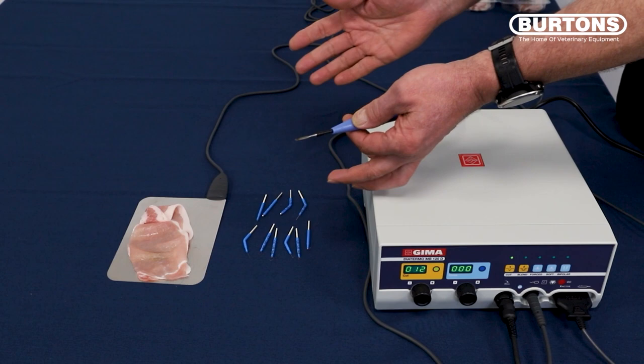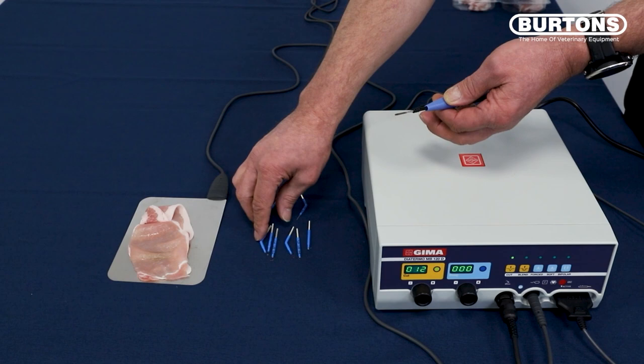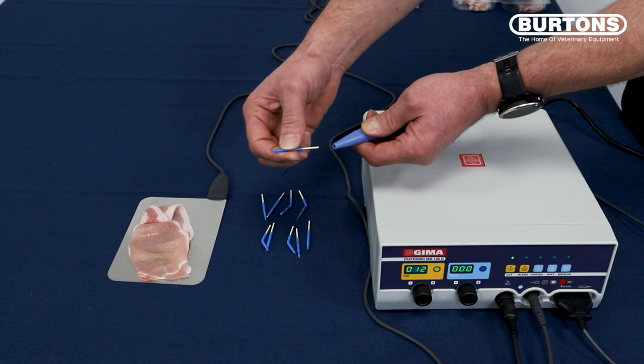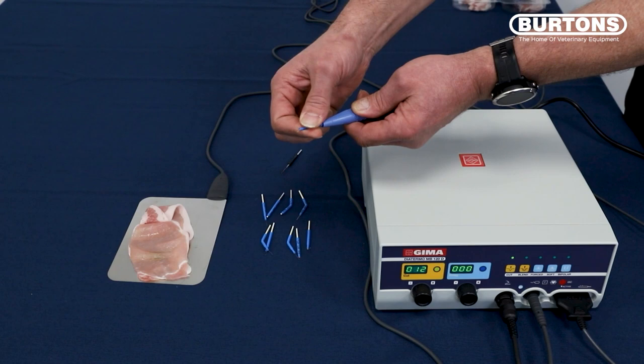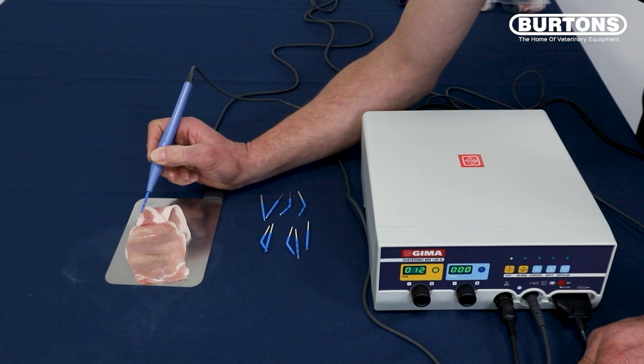I'm just going to change the tip now and select one of the other ones. These are autoclaveable, by the way. If you autoclave them all together in a bunch, once they come out of the sterilizer, you might find they do get stuck together a little bit — you just need to separate them, but that's perfectly normal. To change the tips, we just pull one out, and we're going to put a loop tip in here, which just pushes in. This is handy for biopsies or wart and lump removals. Foot on the foot pedal, and you'll see that we've taken a section of tissue away.